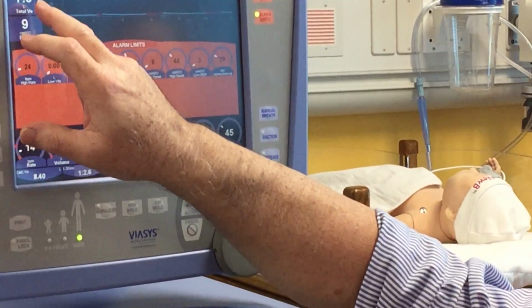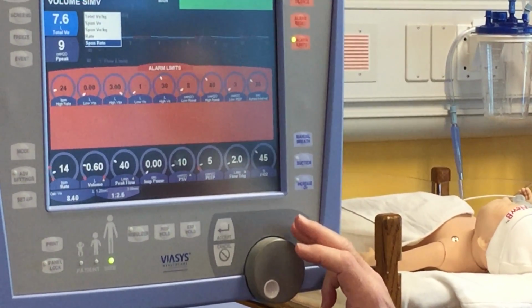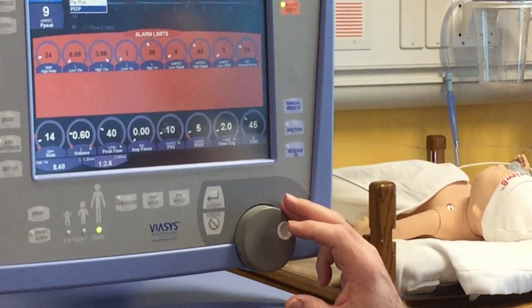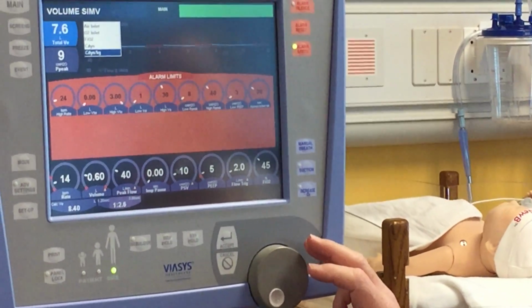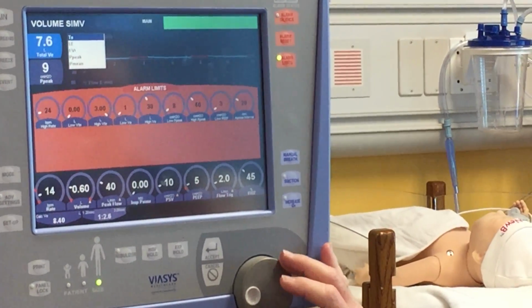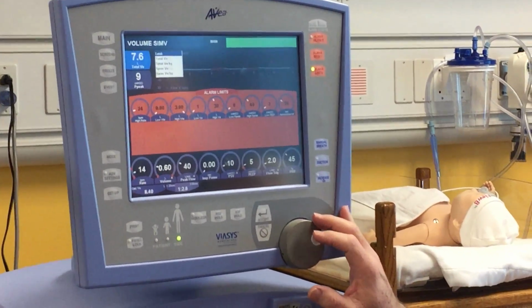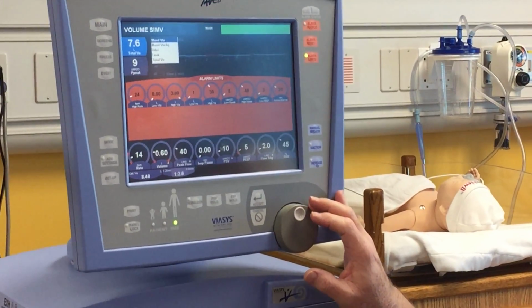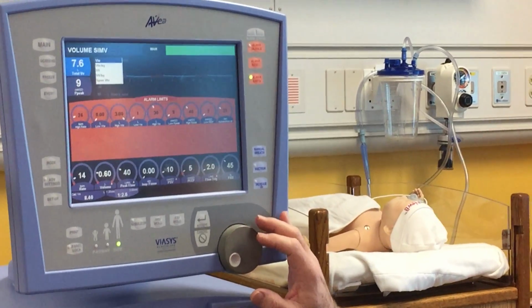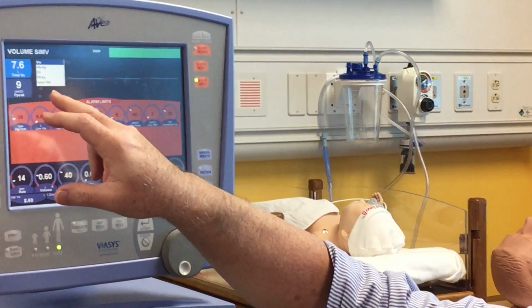Okay. Now, this is where it can get a little confusing. So let's go ahead and let's go in here and let's bring up our VTE. Because remember, the tidal volume we set on the ventilator is not the tidal volume the patient's going to get, right? If I have 600 set, and I tell you the patient's not going to get 600 tidal volume, would you believe me? Yeah. Why? The tubing. Because we're going to lose it in the tubing. There we go. Whoops, one more. VTE. So VTE means tidal volume exhaled.